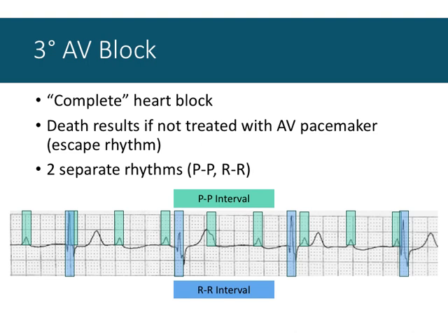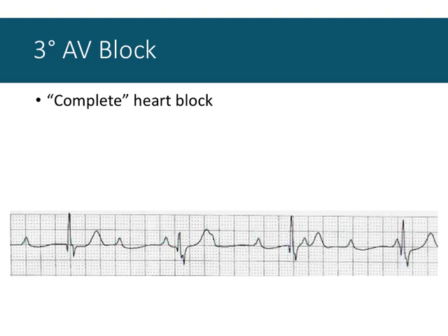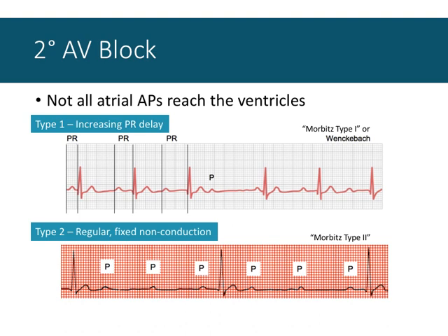Yeah, you have a question? Just to build on to our idea, so if the second degree was treated, does that mean the individual has two pacemakers? If the second degree was treated, the pacemaker is in the AV node only. So the block is at the AV node, at the junction, the point where the atria meet the ventricles. The SA node's fine. You can see in the second degree block regular P waves. The signal doesn't get through, so the problem lies at the AV node.